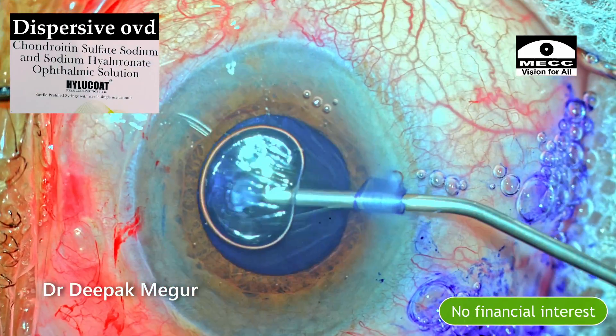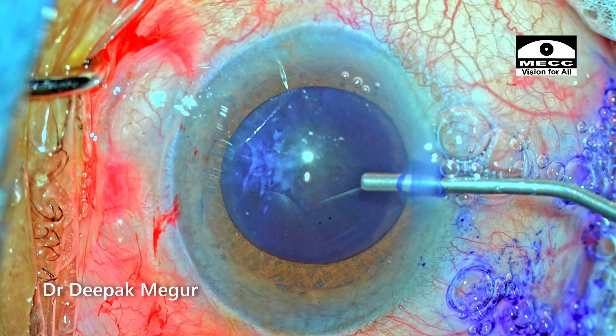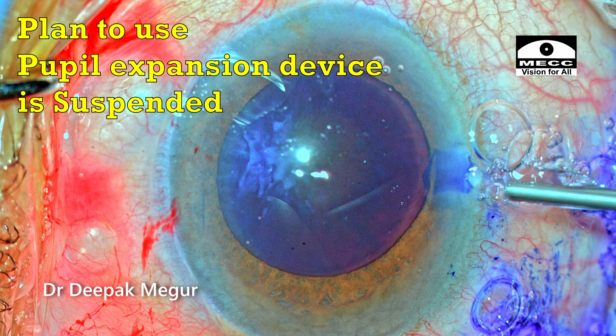I'm using dispersive OVD containing chondroitin sulfate to pressurize the chamber and also to coat the endothelium. After the injection of OVD, the pupil size has increased — a major relief for me. The plan of using a pupil expansion device is suspended as of now.